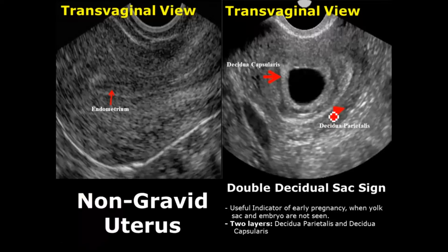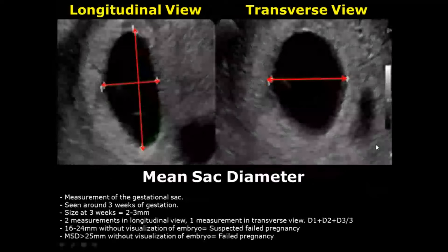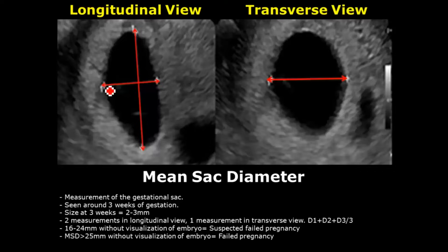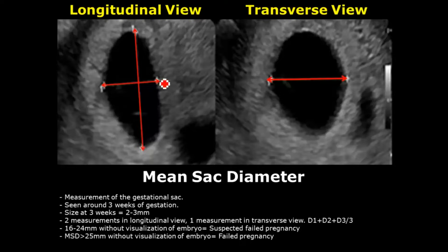The double decidual sac sign is a useful indicator of early pregnancy when the embryo and yolk sac are not seen. It consists of two layers: the outer layer is the decidua parietalis lining the uterine cavity, and the inner layer lines the gestational sac. It is measured by taking two measurements in the longitudinal view and one measurement in the transverse view, then adding these three values and dividing by three to get the mean sac diameter.